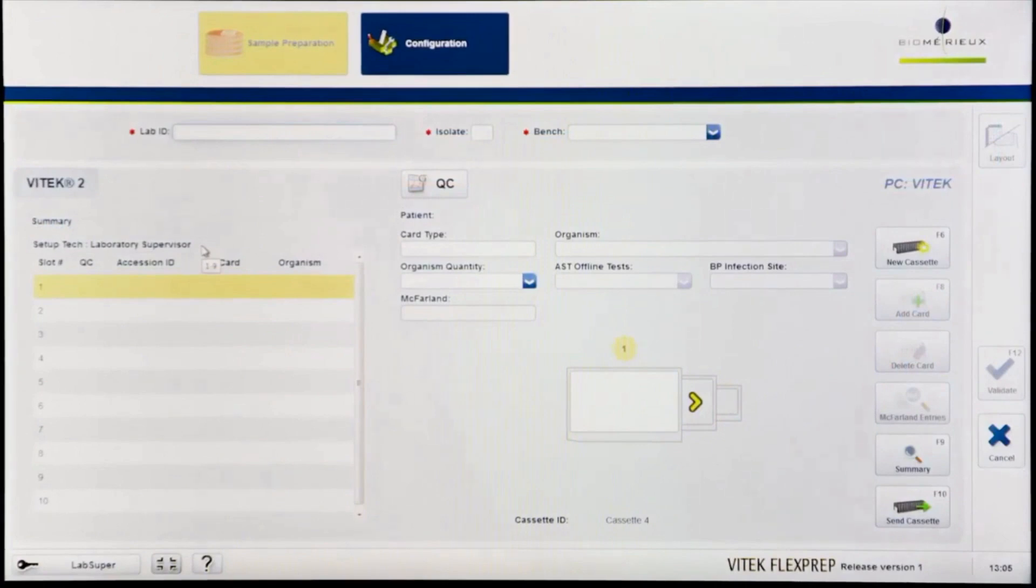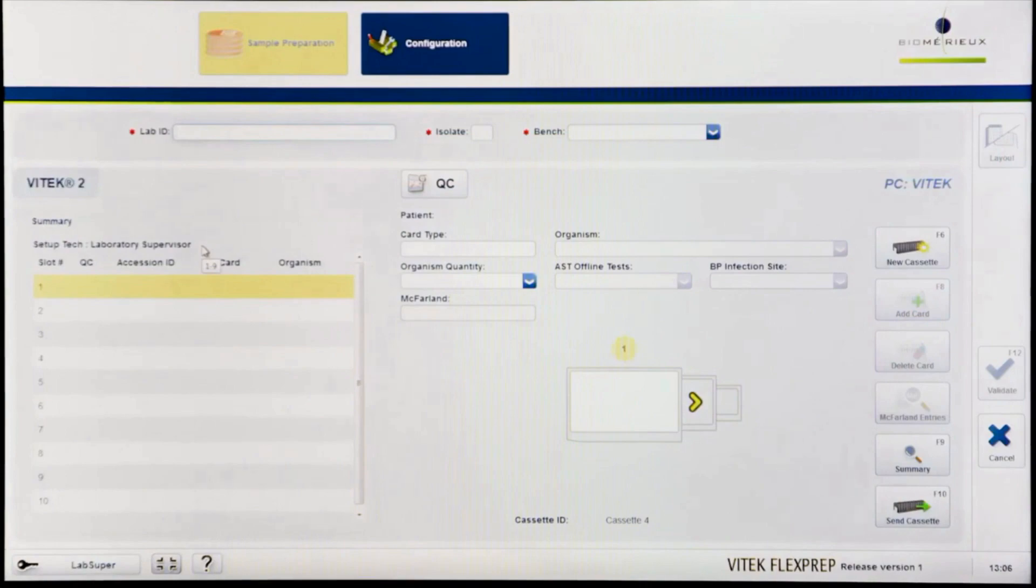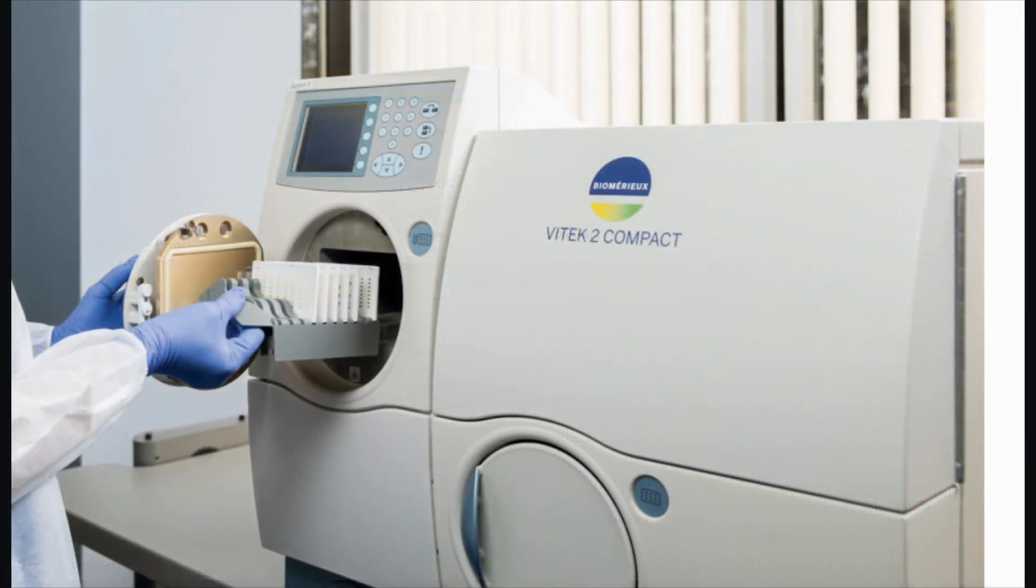If a FlexPrep cassette has already been defined utilizing the desired cassette ID, it must be loaded into the instrument before a new FlexPrep cassette can be defined with the same cassette ID.